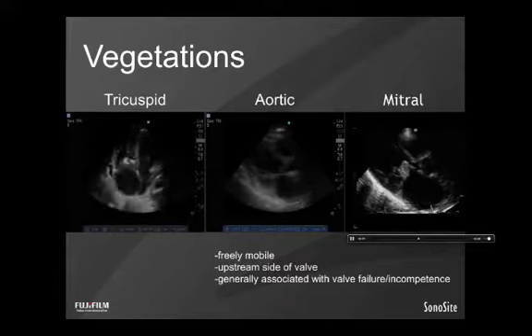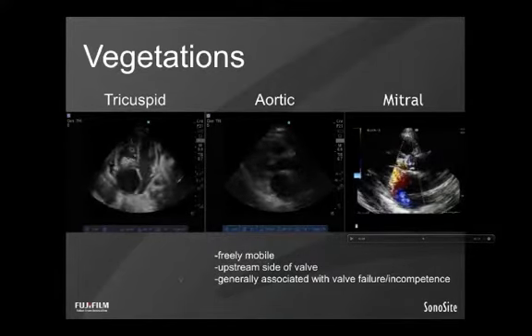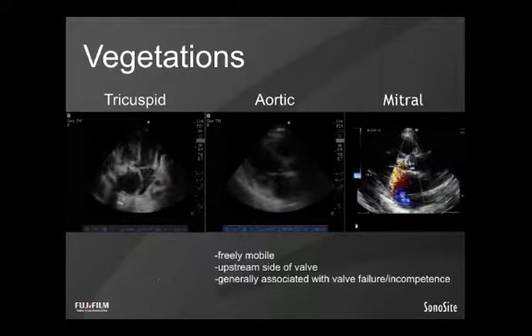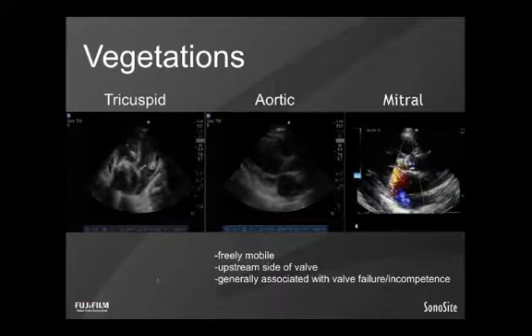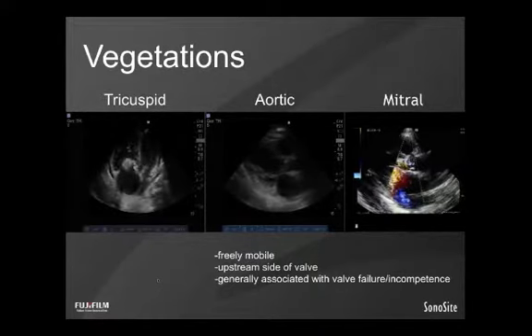So those are the principles of endocarditis. Again, I want to emphasize that we are not endocarditis excluders, but ruling it in and elevating your suspicion with point of care echo is something that is perfectly within your skill set once you become familiar with 2D inspection of valves and their appropriate thicknesses and mobility.